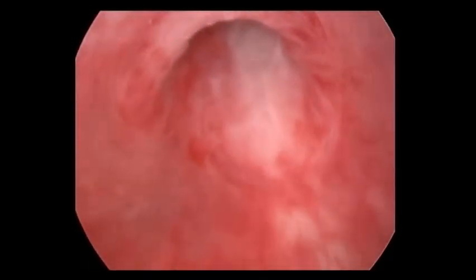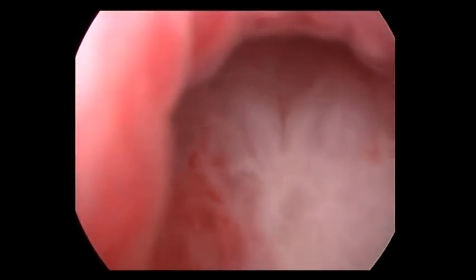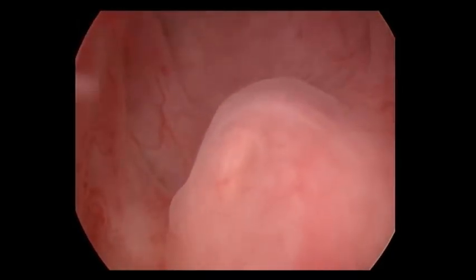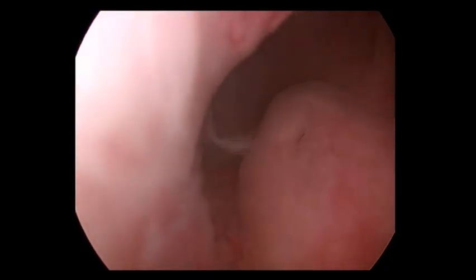This is the male urethra — the cystourethroscopic view. We are going inside without damaging the urethra. This is the verumontanum, with the opening of the ejaculatory duct clearly visible. The prostatic fossa with both right and left lobes is seen, and this is the bladder neck.